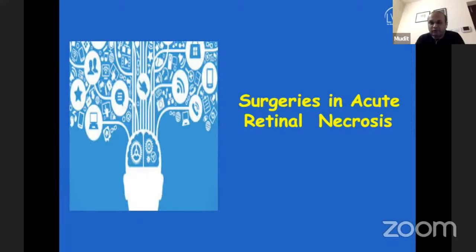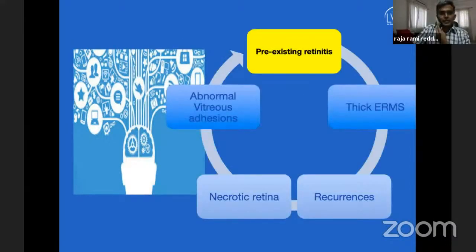So in the next few small video clips, I'll demonstrate how these detachments are a bit different and how we need to tackle them and what we need to do. So the first point is pre-existing retinitis.